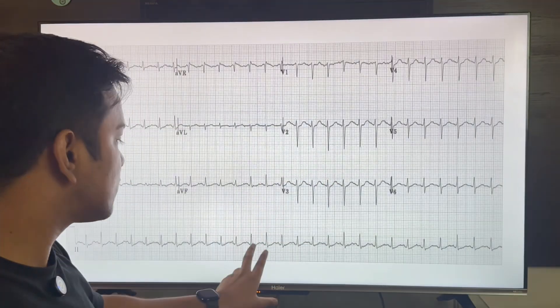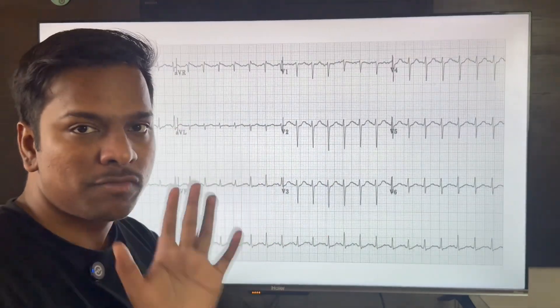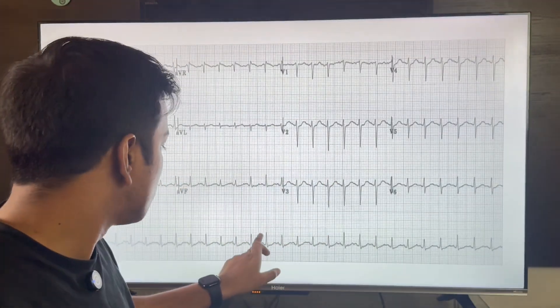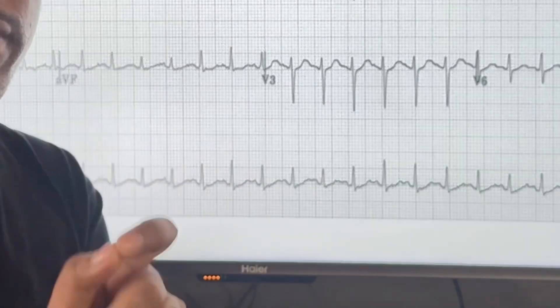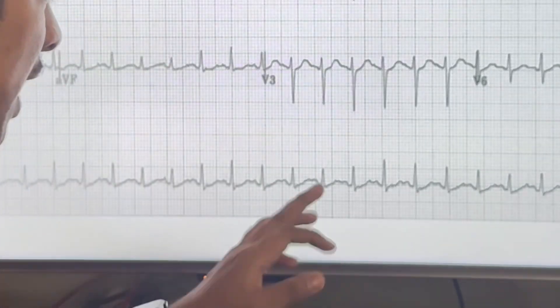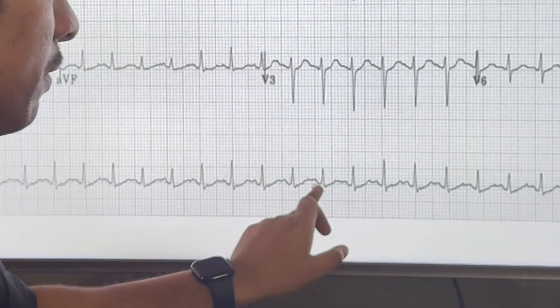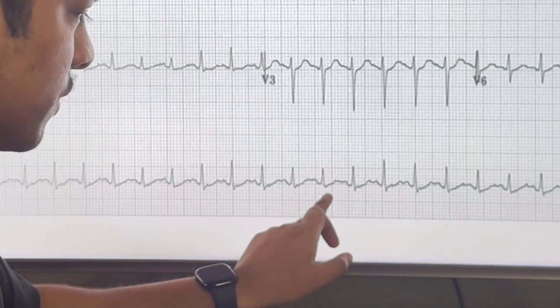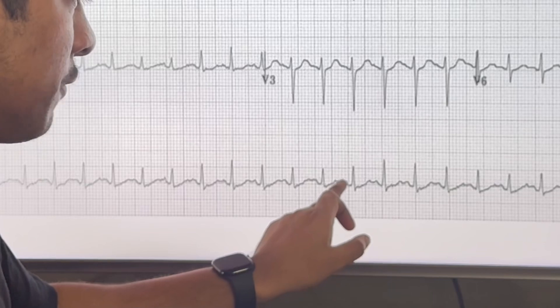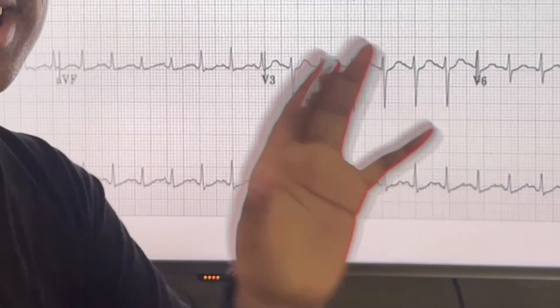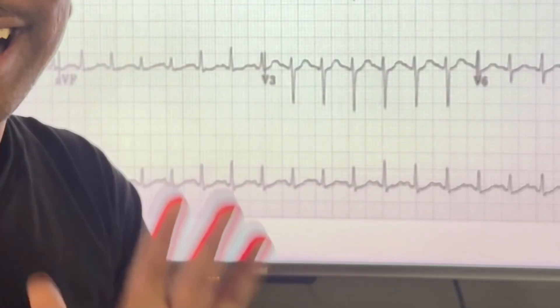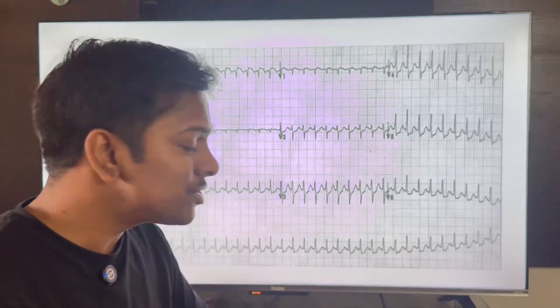In this ECG, the heart rate is faster — 300 divided by 2 boxes gives 150. We can see P wave followed by QRS, then P wave, then QRS consistently. This has to be sinus tachycardia.